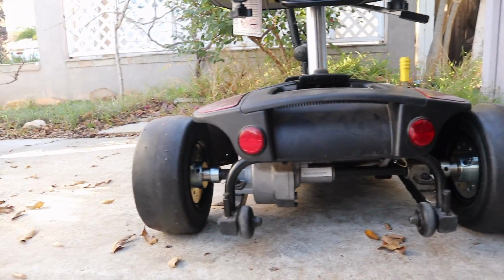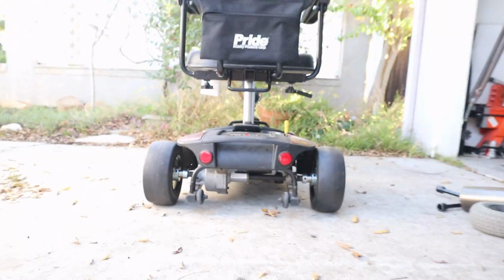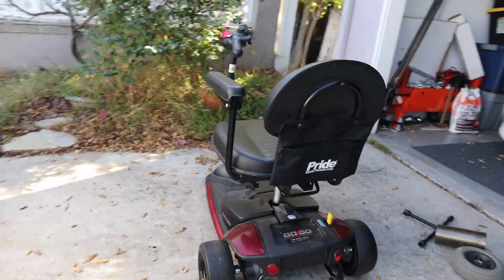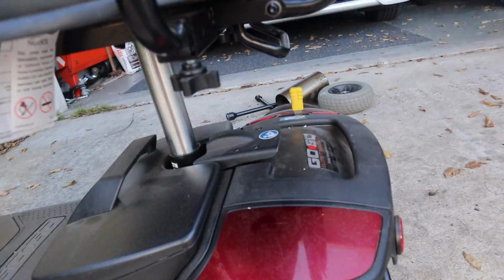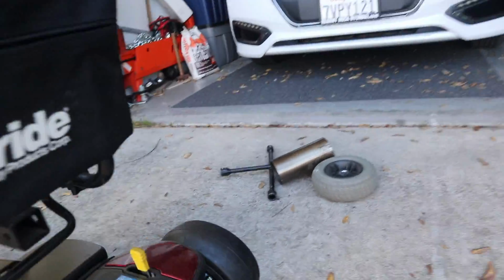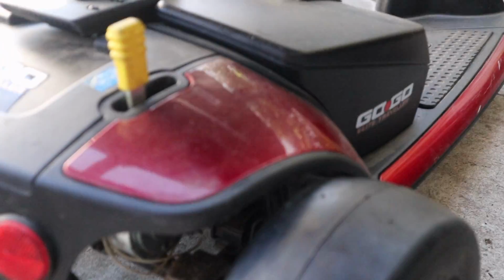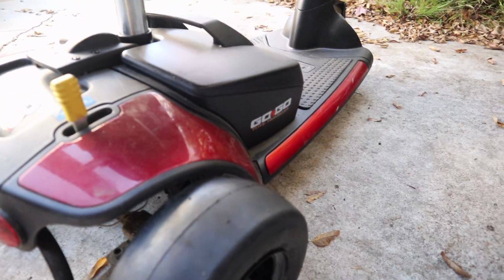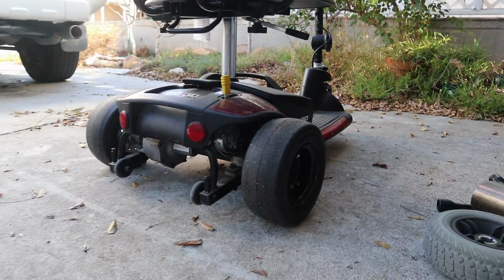Just put the second wheel on, and damn, this thing looks so aggressive from the rear end. Oh my goodness. Wow. I think just all around, this thing looks so much cleaner. I ended up cutting just about the same amount, and it came out to be the same fitment on this side, which is what you want. You want identical fitment. Oh man, it just looks so good too. Oh my goodness, definitely a swap worth doing.